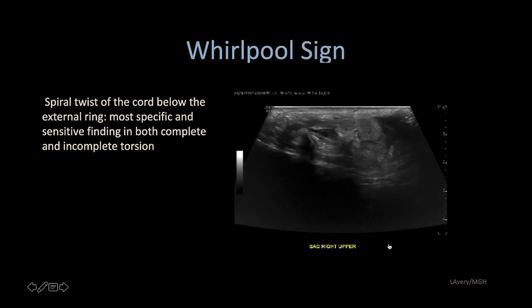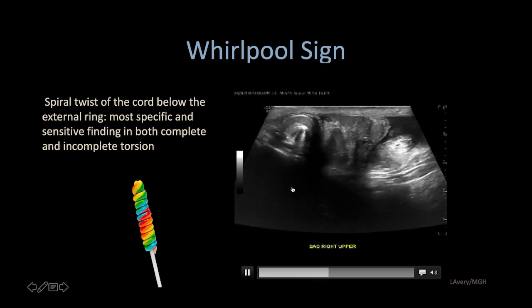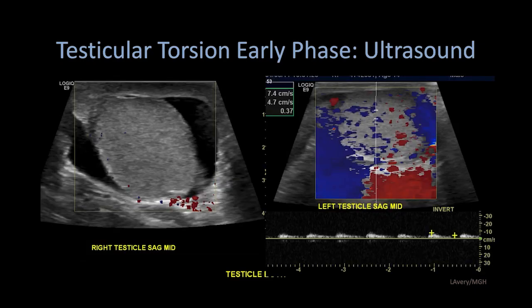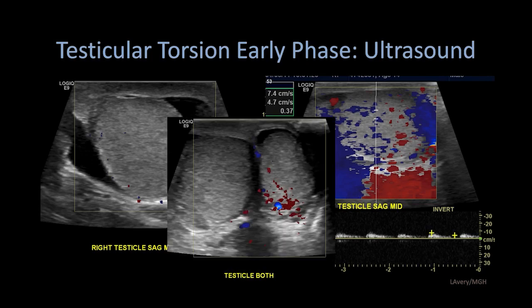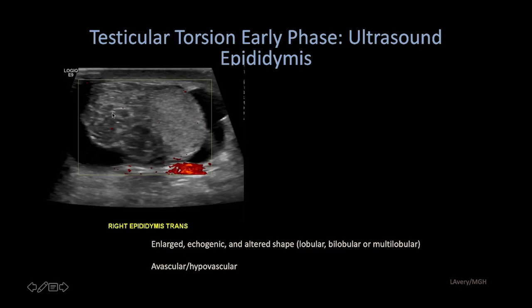Now we'll see the whirlpool sign of the twisted spermatic cord — this nice whirling, twisting appearance. Here's another case of testicular torsion where the testicles have similar echogenicity bilaterally, but there's a small reactive hydrocele on the right. Doppler imaging demonstrates no discernible blood flow within the right testicle, consistent with testicular torsion. This is the buddy view — the right and left testicles on the same image to confirm consistent Doppler evaluation. On further evaluation, the epididymis is enlarged and heterogeneous in echo texture but without any blood flow within the epididymal region, unlike epididymitis which would show increased blood flow.